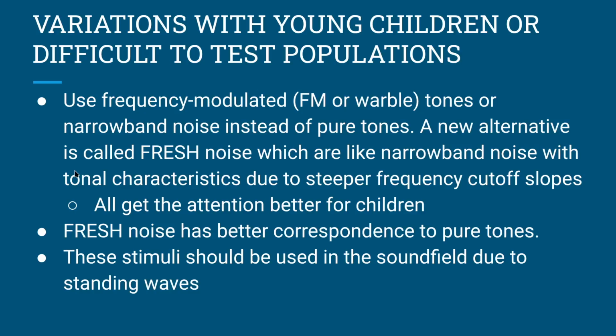A new alternative is called fresh noise, which is like narrowband noise with tonal characteristics due to steeper frequency cutoff slopes. I take that back. Fresh noise has better correspondence to pure tones than narrowband noise. Fresh noise I have not used myself personally. It's a proprietary type of noise, not available in all systems, so narrowband noise is more widely available. These stimuli should be used in the sound field: narrowband noise, warble tones, fresh noise, due to standing waves.